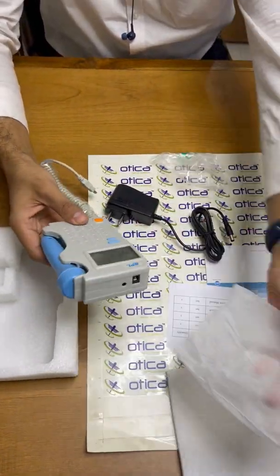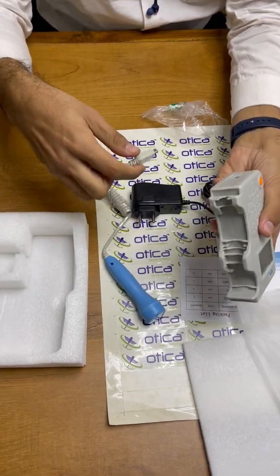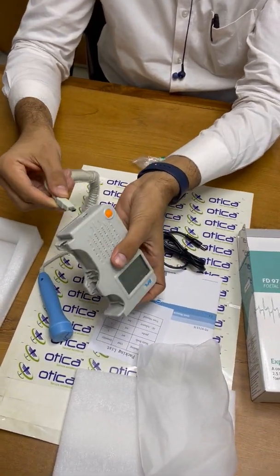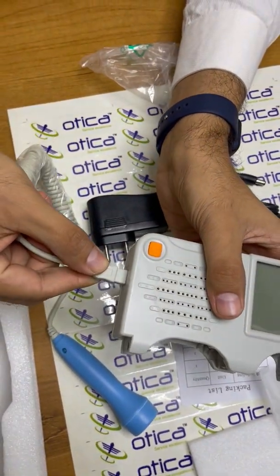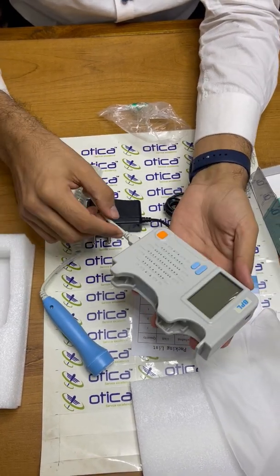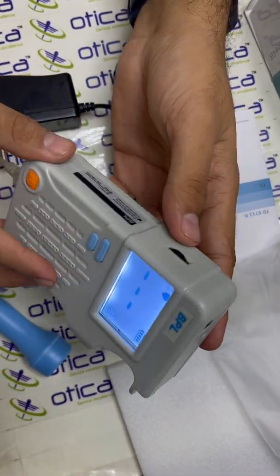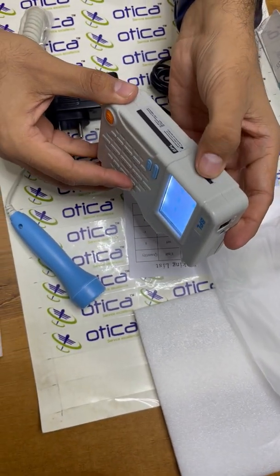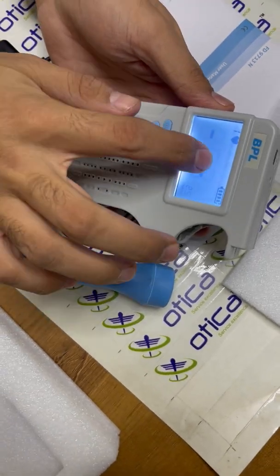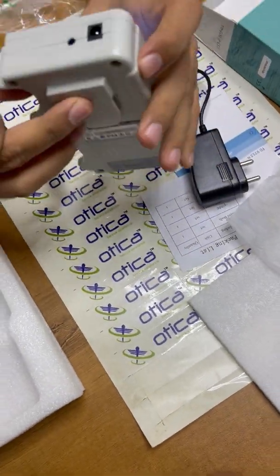This is the BPL fetal doppler — BPL is a good brand. This is the fetal probe which you have to keep on the belly of the pregnant woman. The probe is connected in a proper manner. You have to try it a bit to set it properly. You can see this is the power button — you can press it to turn on the device. You can adjust the volume using this volume control panel. This is a 2.5 megahertz machine with an LCD display, and the machine is rechargeable.